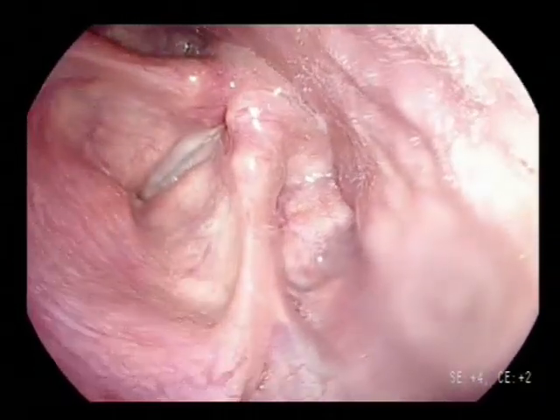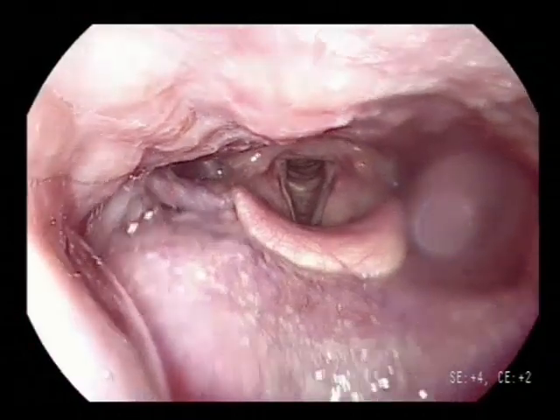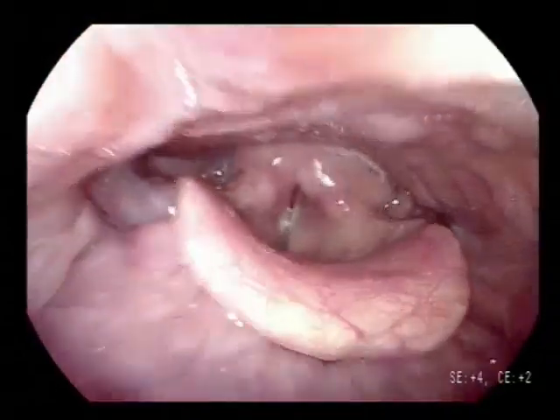When examining the left piriform sinus, the patient should look to the right, and the other way around. During inspection of the piriform sinus, pay close attention to the medial wall.